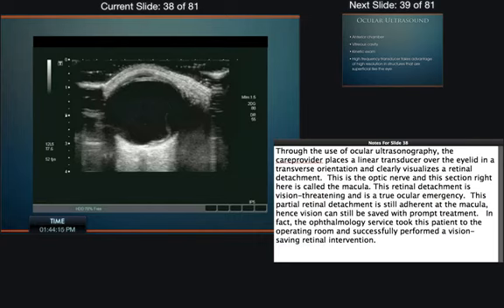So we're on the phone right away with our nice ophthalmology colleagues, and we explain to them that we have a MAC-on retinal detachment, or it's still attached at the macula. And that's what's happening, right? The retina is pulling back away from the other part of the eye, from the choroid. It's still attached up here at the ora serrata, but because it's starting to get near the macula, the patient is having these weird symptoms of, yeah, I can see okay now, but once in a while it feels like a shade is being pulled down, or I see a bunch of floaters in my vision, and you're like, but I'm checking your visual acuity now, it's normal.